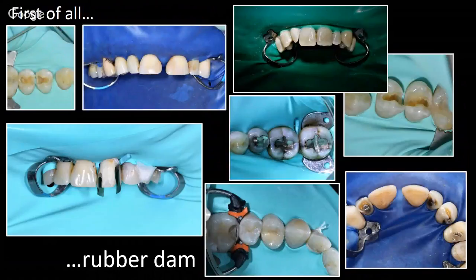Why the rubber dam? Because with rubber dam is the only way we have to fully control the humidity, fully control the contamination. And not only that, if we use a rubber dam, we are much more focused on our restoration, on our cavity.